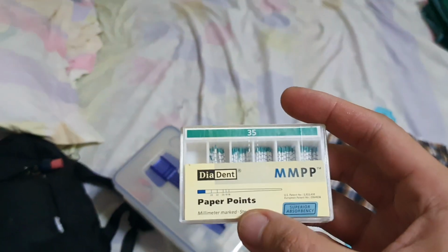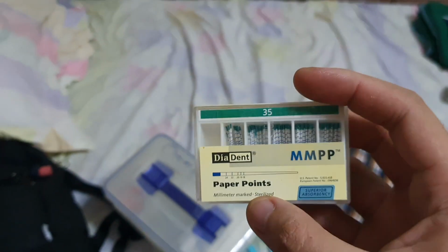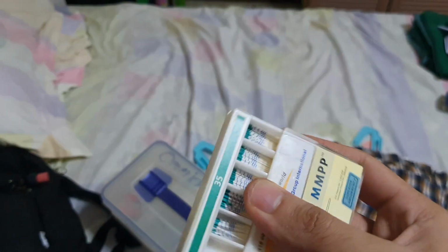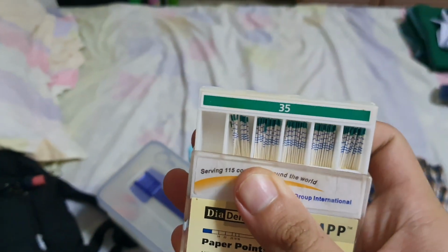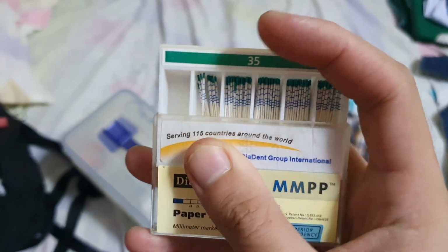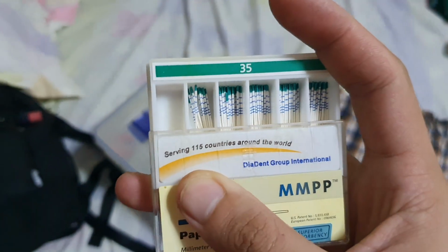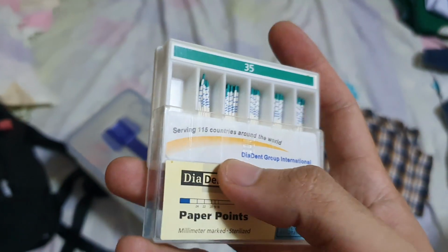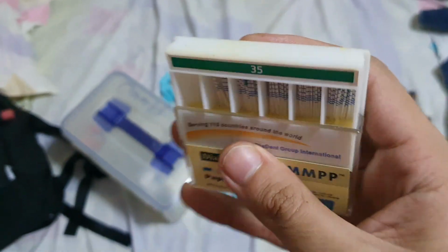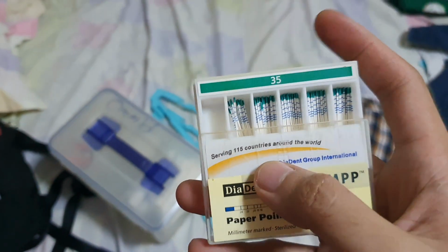And these are the paper points. The paper points are used to dry up the canal. I have four of these boxes, but the other two are in school. So yeah, this is used to dry up the canal if we're done enlarging with sodium hypochlorite solution with water, of course, diluted. It's a case to case basis.